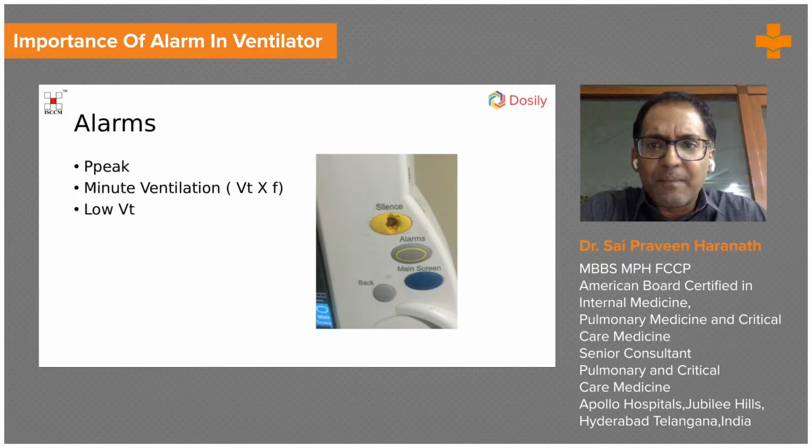This is in my hospital a long time ago. The most used button is the silence button. See how worn out it is? You keep pushing on the silence button and you shut off the alarm. But please don't do that.